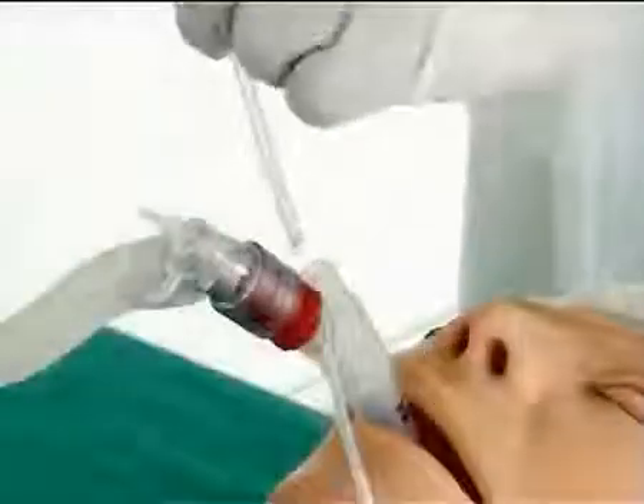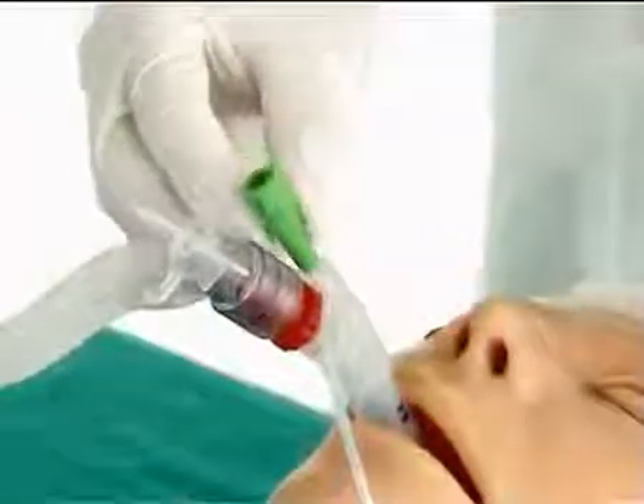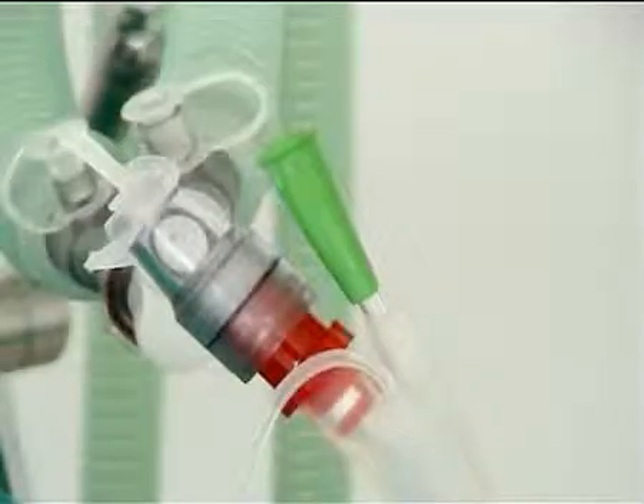The drain tube of the LTS is used for stomach pressure release and allows the insertion of a suction or gastric catheter of maximum 14 charrier.